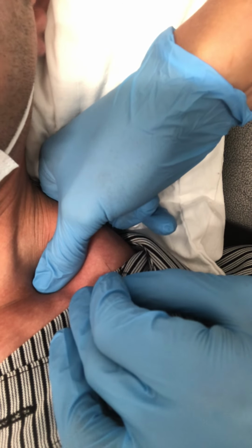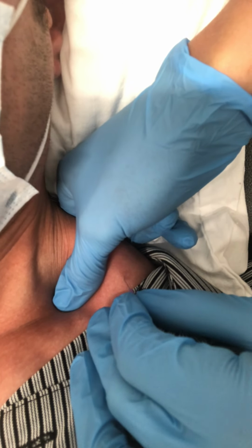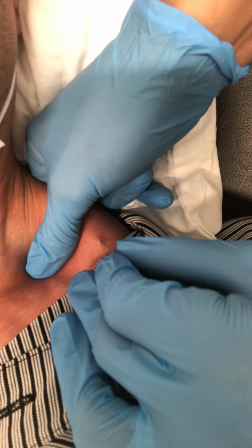So Sean, if it's really grabbing, which it should be right now, you can tell if Sean's trying to pull that needle out, it's not going anywhere because that fascia is really grabbing at the needle. Right there, yeah. And again, if this is an actual treatment, we may leave that in there for 5 minutes or so. Okay. So we'll take that out.